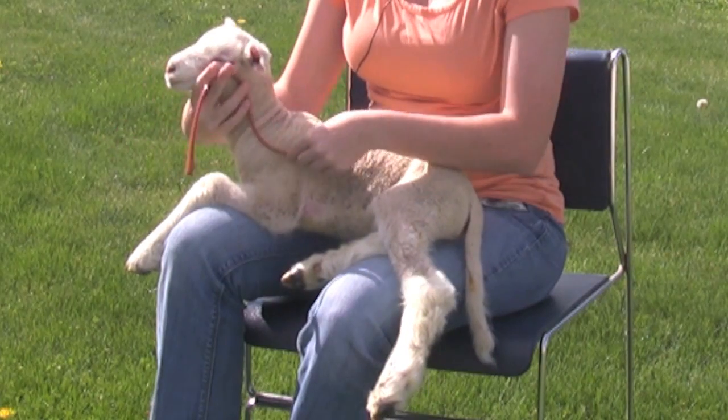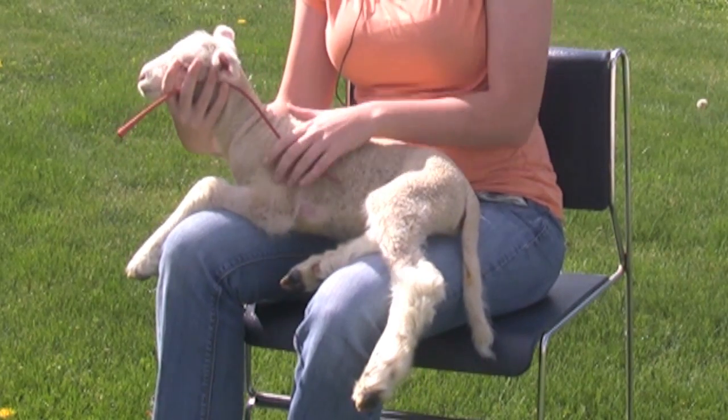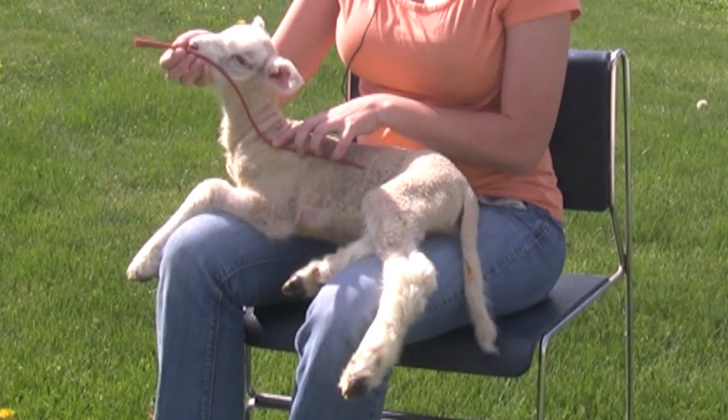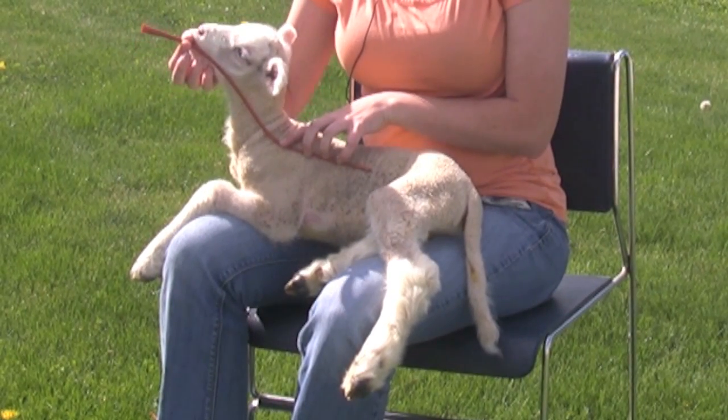To determine how far into the stomach the tube must go, lie the tube along the lamb's body so that it reaches the last rib. This will give you a reference point on the tube when you insert it and begin feeding the lamb.